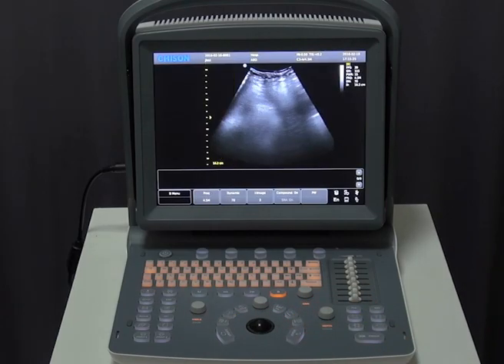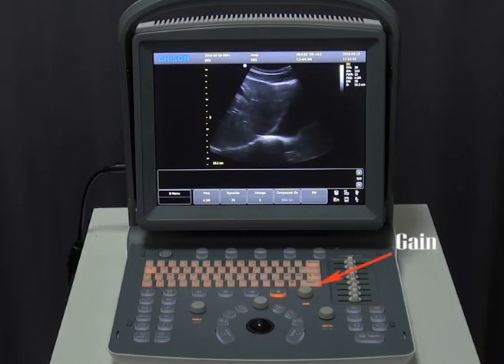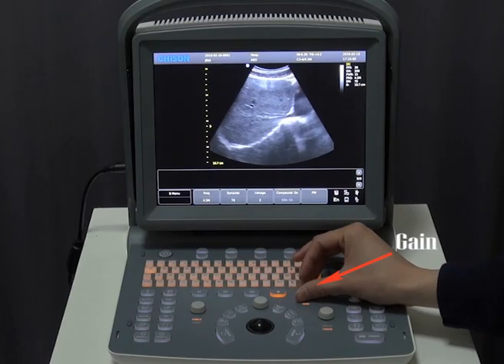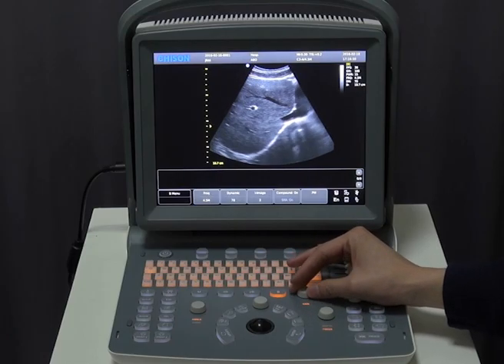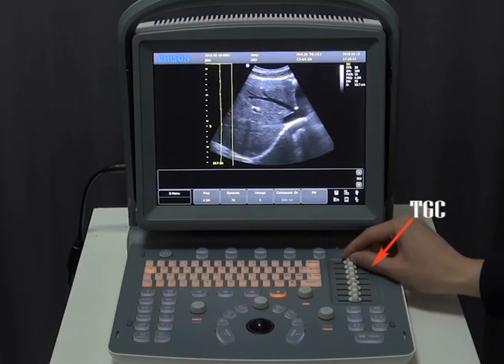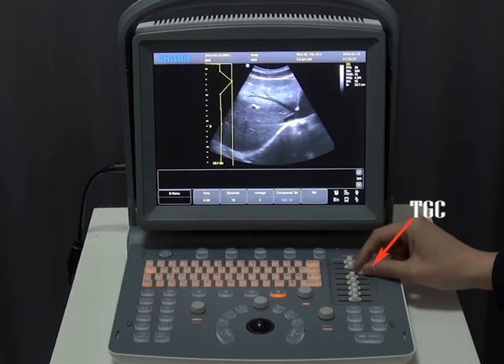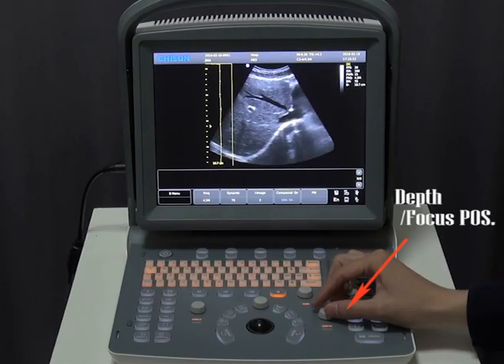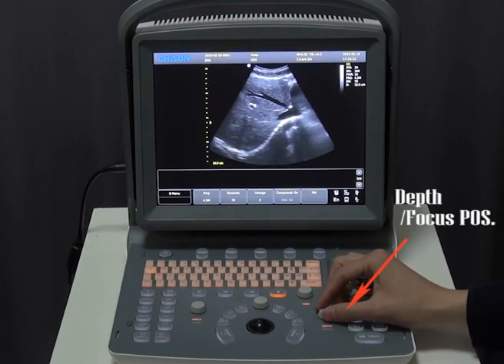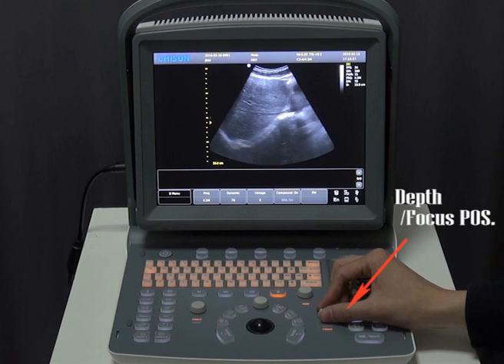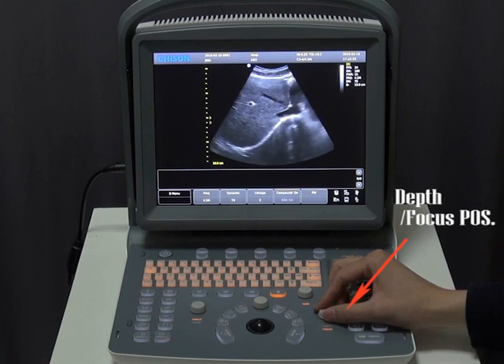Now we are in B mode. Twist this button to adjust the overall gain, while sliding different segments of the TGC changes the gain at different depths. Rotate this button to adjust the depth. Press it to switch to focus position adjustment.